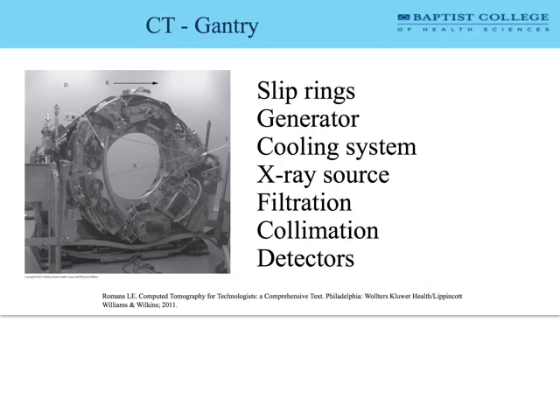The power capacity of the generator is generally talked about in kilowatts, and this is important because the diagnostic range of energies is in the kilovolt range or kVp range. When we're talking about therapeutic energy ranges or energy ranges related to gamma radiation, sometimes we get up into the mega electron volt range, and that's quite a bit more, right? So that's not what we're playing with for us. We're using kilowatts to produce kVp.